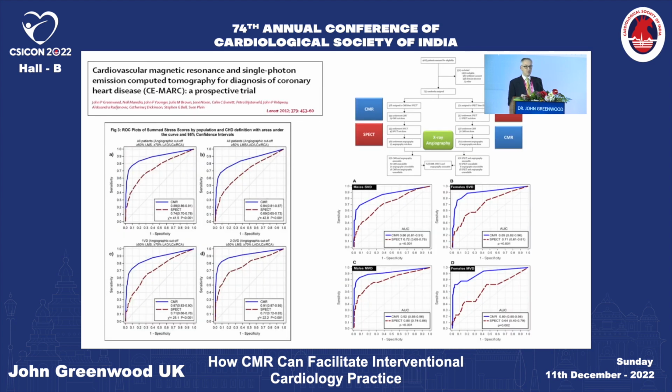And I'm going to show you just one of the landmark trials, first of all, in CMR. And this was quite controversial when it came out. This was a randomized trial that we conducted in our center in Leeds, whereby of all of the 750 patients who went into the study, all of them had CMR and SPECT. It was just randomized to the order of those. And then irrespective of the result, they all had invasive coronary angiography.